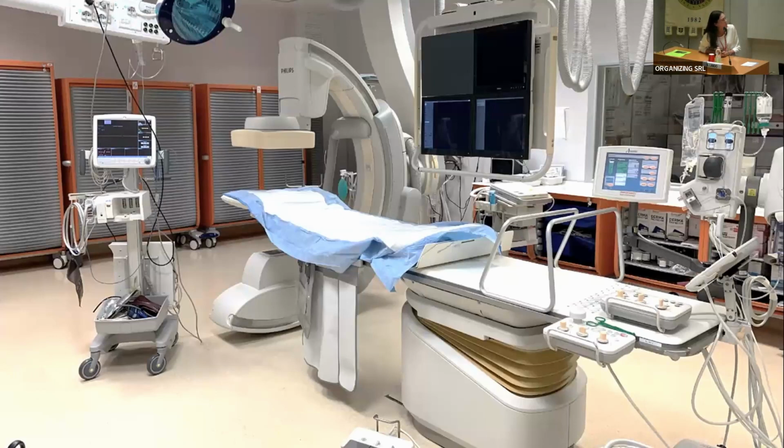There's the bed where the patient can lay during the procedure of the biopsy, laying on the prone or supine or lateral decubitus position. There's the angiographic machine with the cone-beam CT integrated into it. There's the pump to inject contrast medium as required by the operator. There's a multi-parameter monitor to follow the vital signs of the patient.